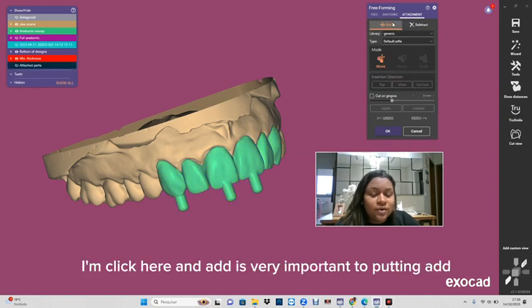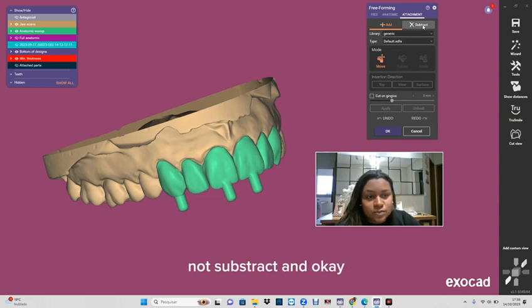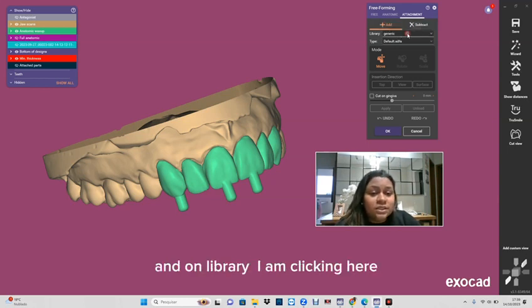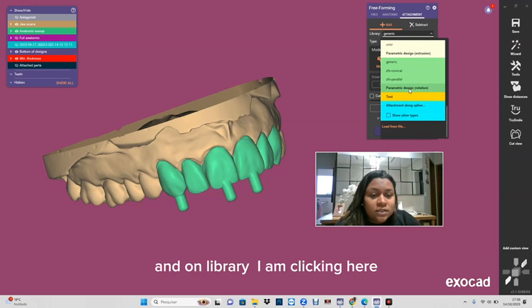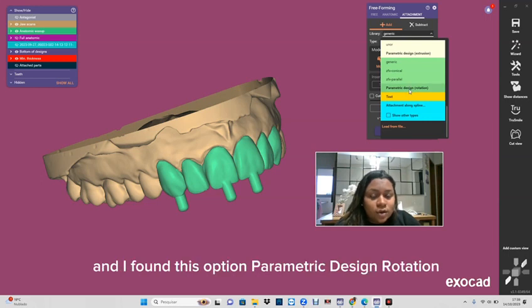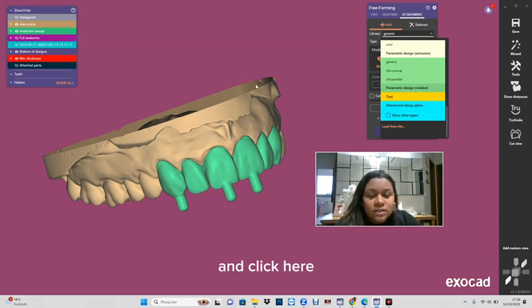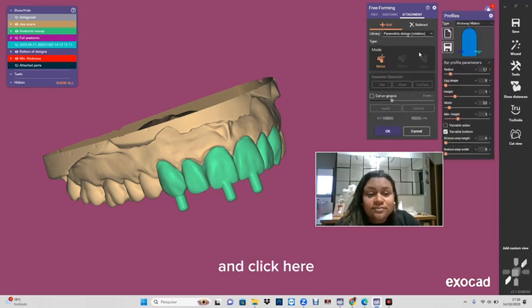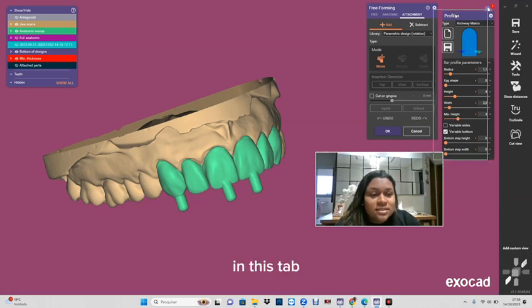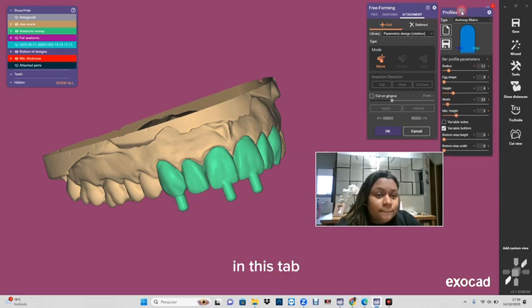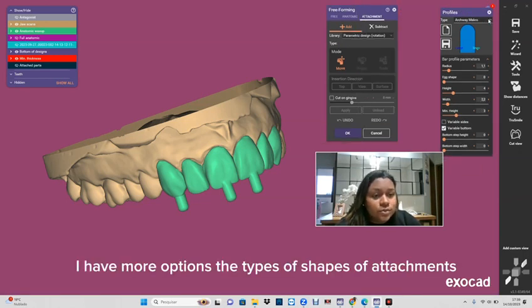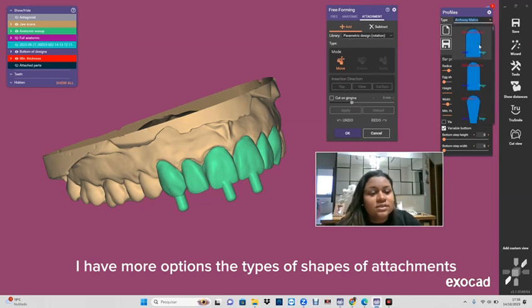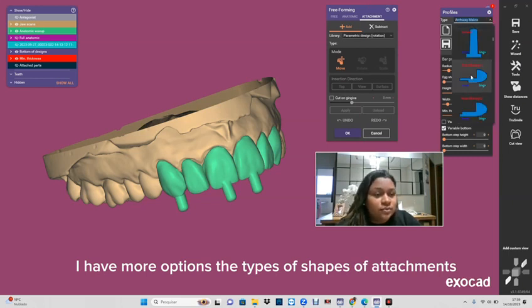Add is very important - putting add, not subtract, okay. And here I'm clicking and I found this option: parametric design rotation. And clicking here in this tab I have more options, the types of shapes of attachments.